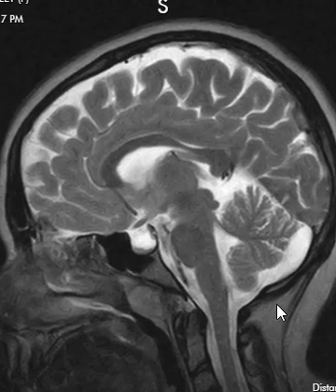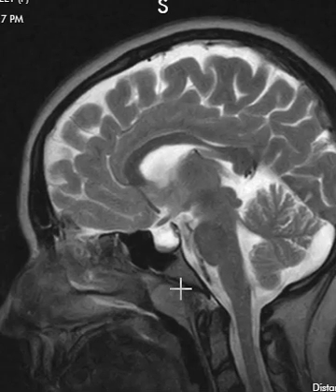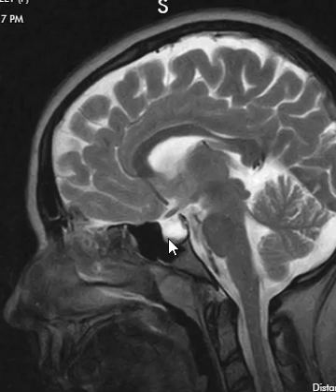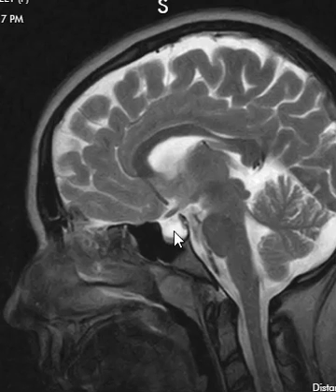So the latest doctor decided to get an MRI, and here is a midline cut through the brain. We can see the problem right here. This is the sella. It's borderline expanded — about 1.4 centimeters in AP dimension and 11 millimeters in vertical dimension. We see the fluid-filled sella here.